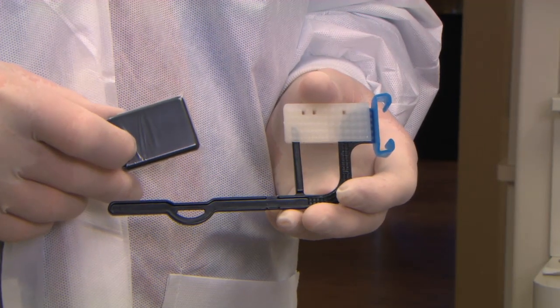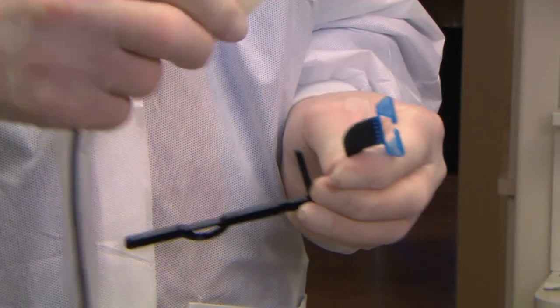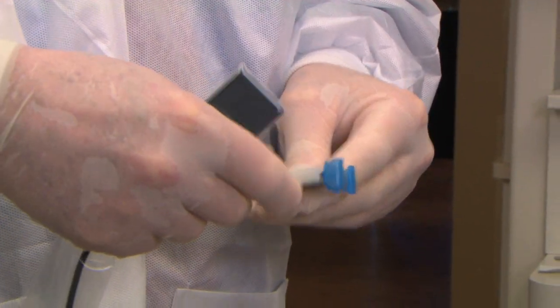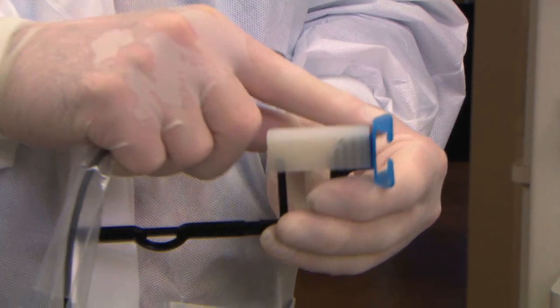For the anterior PAs, you use the TrollByte Kimera Blue. The holder has a removable bite block that slides on the bite tab. It has a slit in the front. The small pin supports the rear of the bite block. Push it flush against the claw.